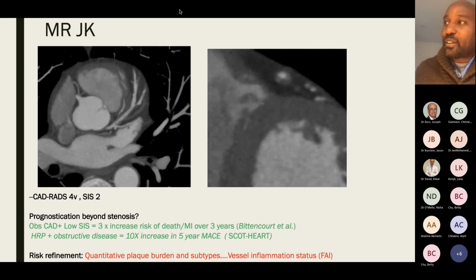And that's why, for me personally, I see a calcium score of 100 or more as higher risk, because a lot of the studies tend to show increased event rates above that. But it's never been tested in randomized trials as to what your cutoff is and how much plaque you're visualizing is necessary before you see an impact of intervention. So it is a bit unclear right now.